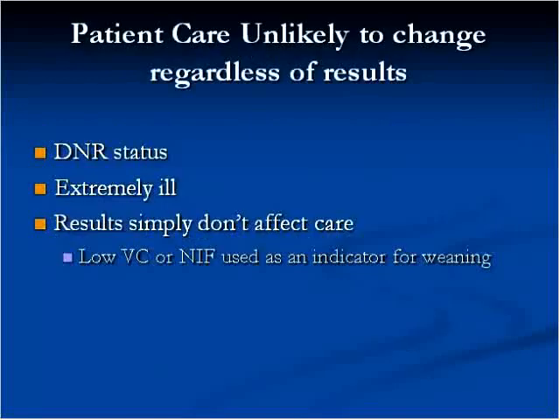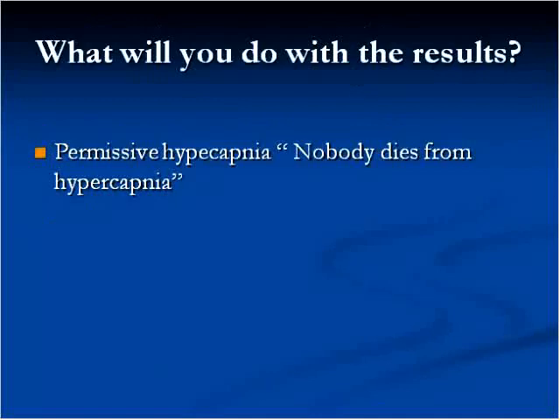And I do have some concern about going to point-of-care technique, the third bullet point, where we have people who really have no experience in drawing blood gases who are drawing the blood gases. You're not going to change diagnosis.